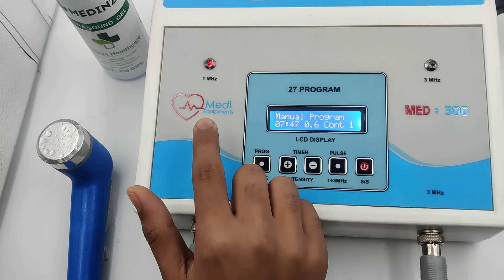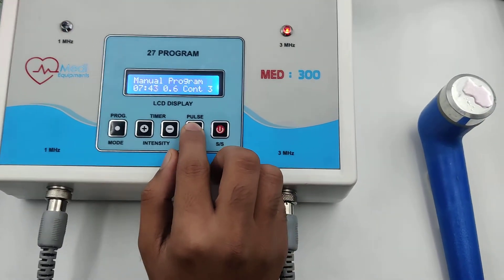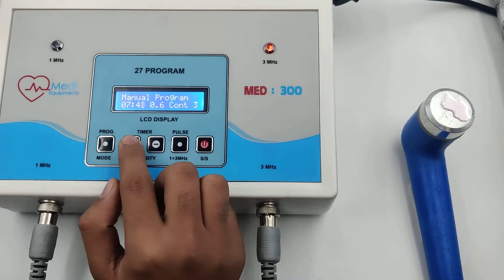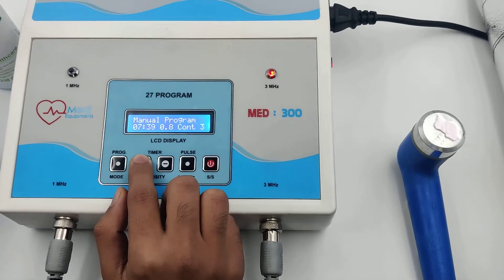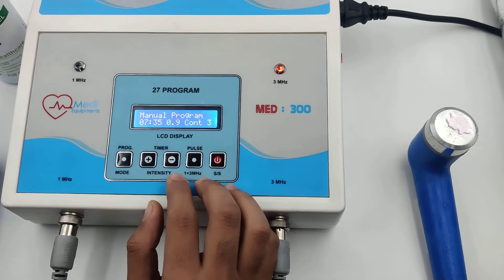Now you can switch the current from 1 MHz to 3 MHz by pressing this button. You can again increase the intensity. After treatment is completed, stop the machine.